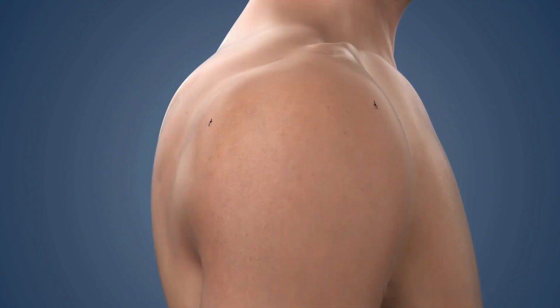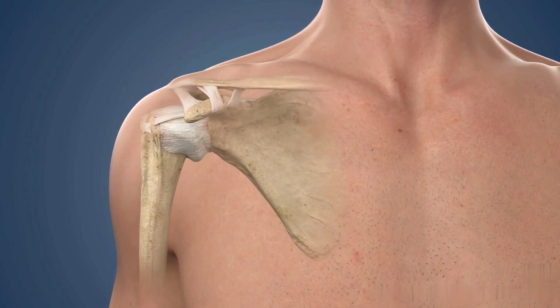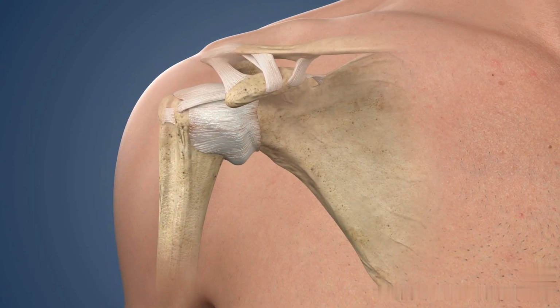Surgical repair techniques vary depending upon your surgeon's preference, the severity of your tear, the tissue quality, and your individual anatomy. These techniques include open repair, mini-open repair, and arthroscopic repair. This animation will explain the common arthroscopic repair.